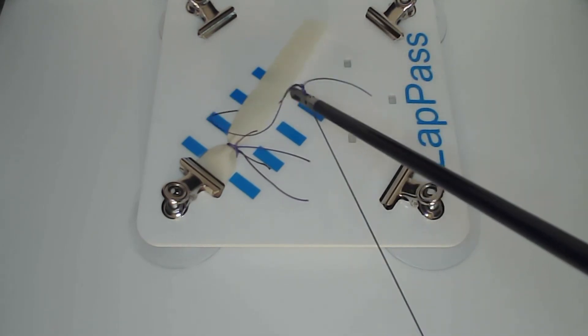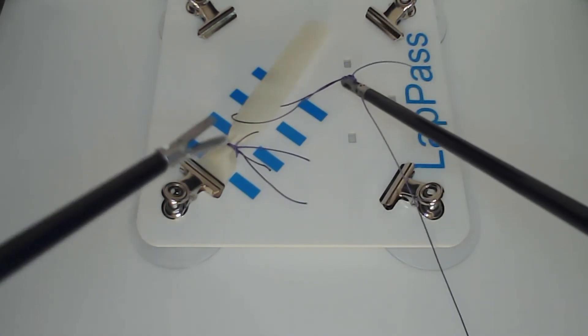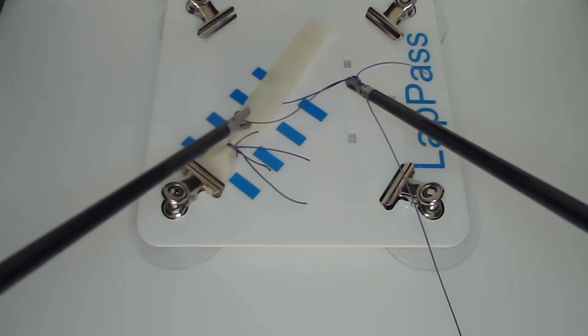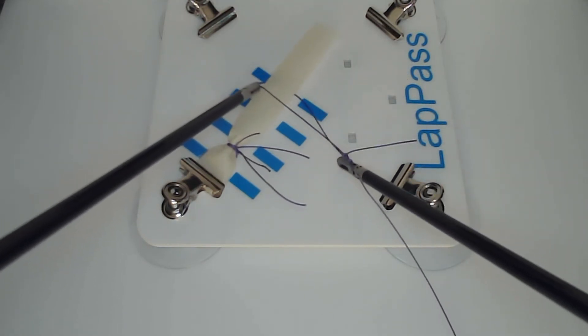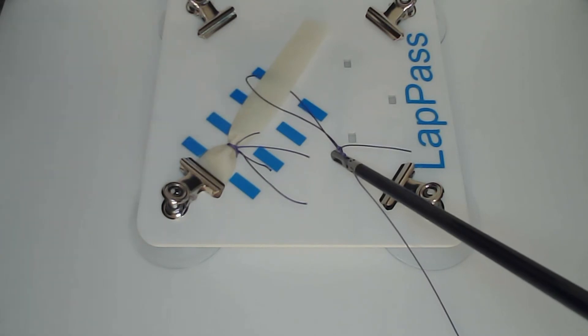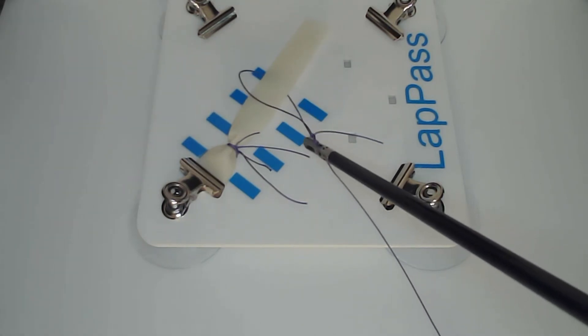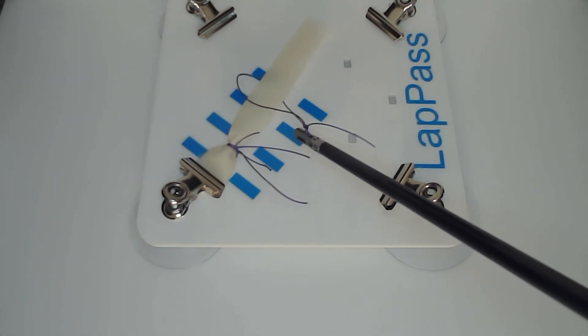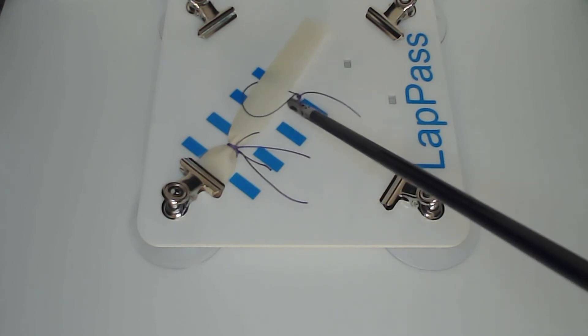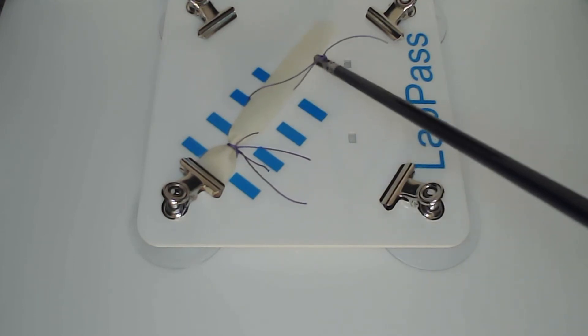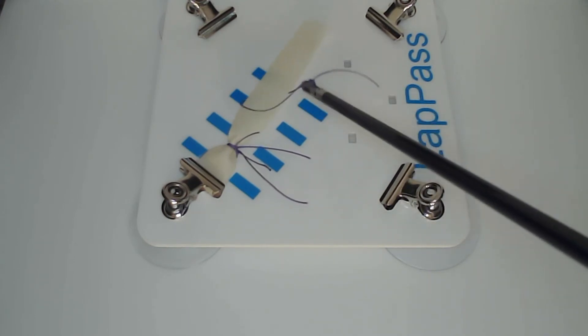Form the knots carefully in the loop, and when placing in the box ensure that you're holding on to the knot so that it doesn't close prematurely. It's important to place them definitely within the zone so that they're isolated properly and then secured.